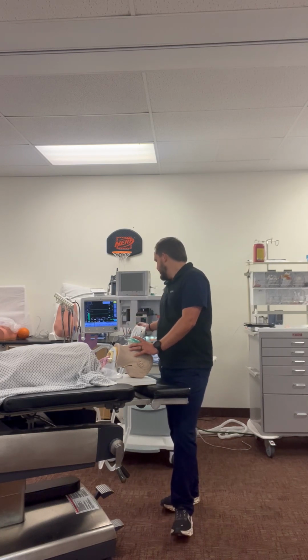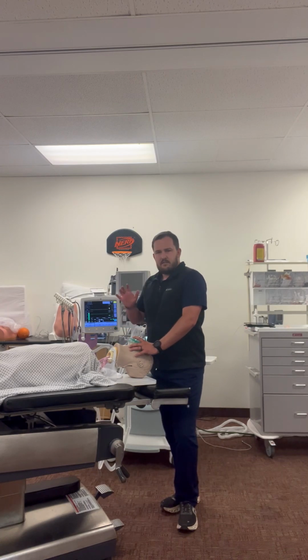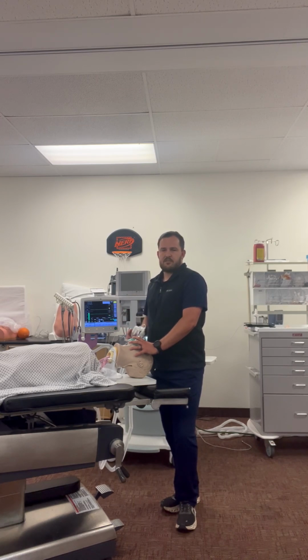So I'm going to close my APL valve, and then I'm going to squeeze my bag, not necessarily squeeze, but just hold on to maintain a pressure of 20 centimeters of water. And then if that doesn't work, I can deepen the IV anesthesia with more propofol. If that still doesn't work, I can give IV or IM atropine and succinylcholine.